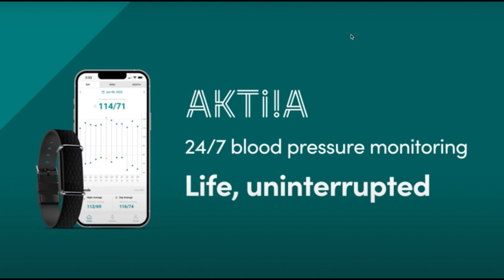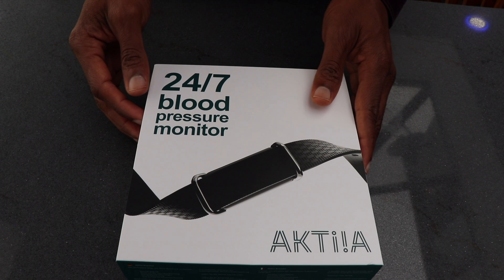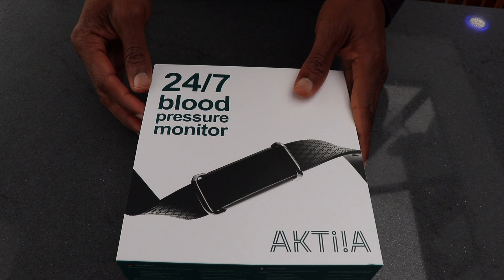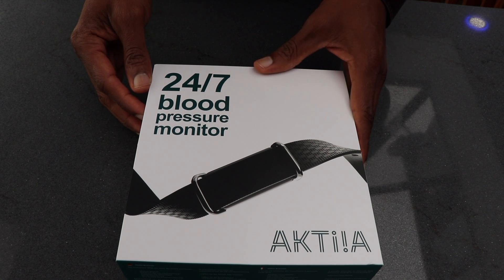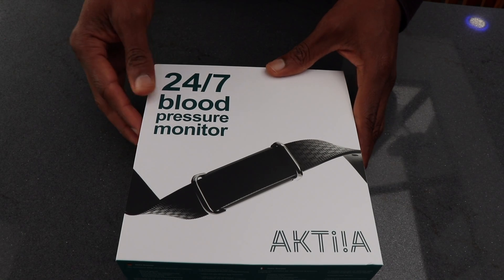I have to give it to them — I think it's a positive step towards being able to monitor your blood pressure throughout the day, but I don't think it goes far enough and I'll discuss that later. So let's see what's in the box.